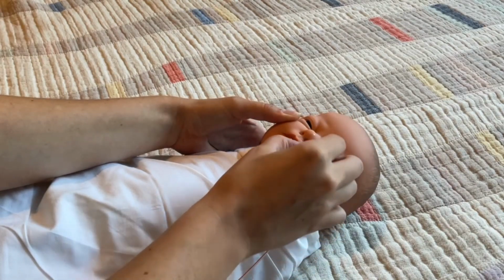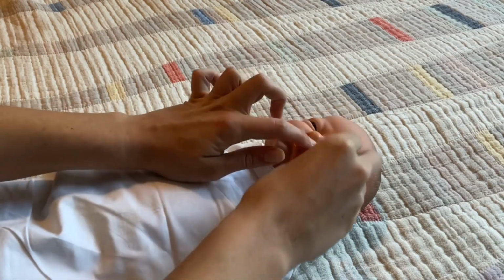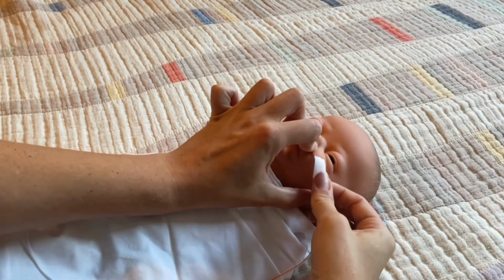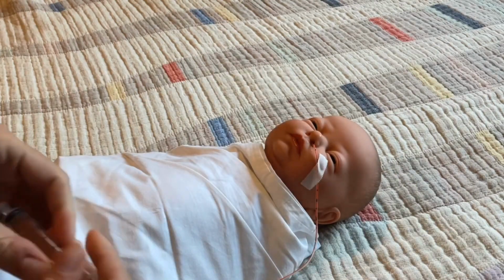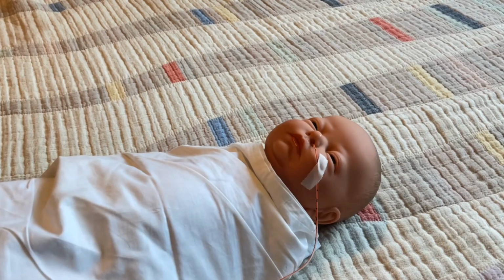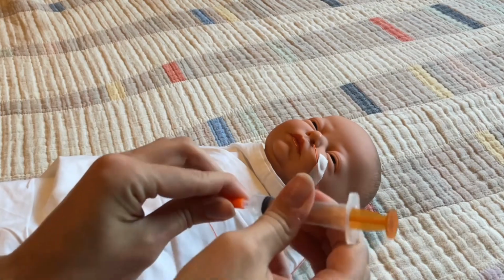Find your length that you marked, and when you get to that point, stop inserting. You can lightly tape down the NG tube so that you can verify placement. To verify placement, you're going to take your syringe and pull back air. Attach the syringe to the end of the NG tube.